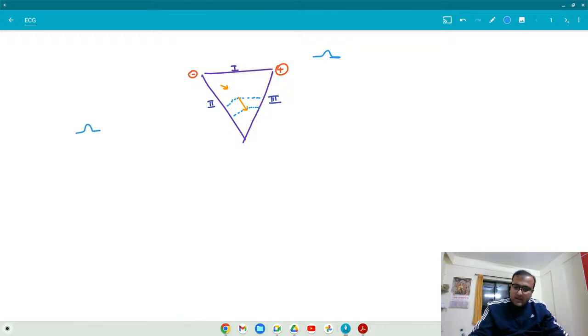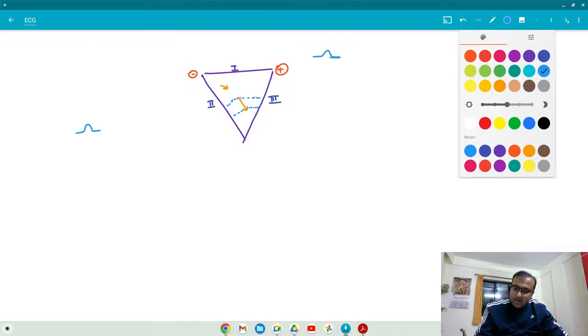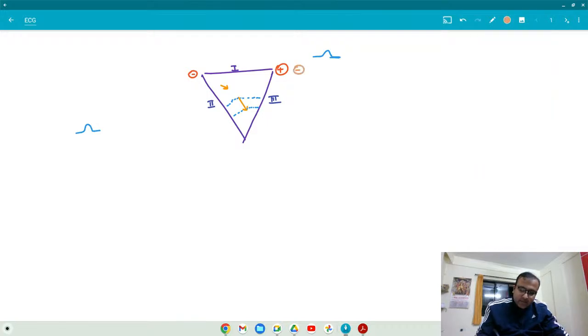What happens in lead 3? Let me remind you what happens in lead 3. In lead 3, this one becomes negative and this one becomes positive. So now accordingly answer me.